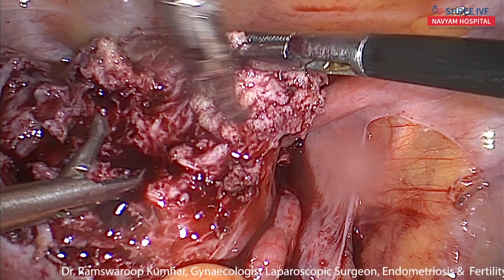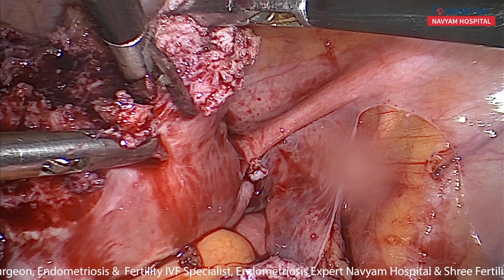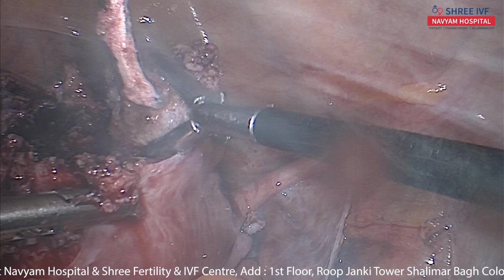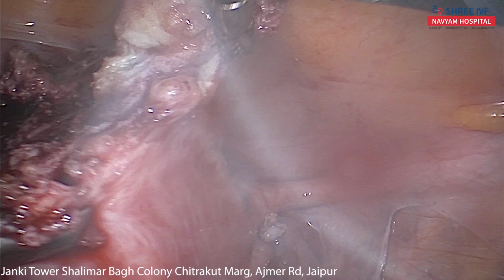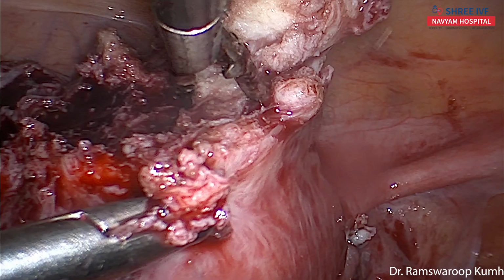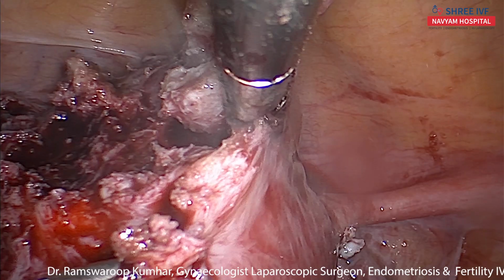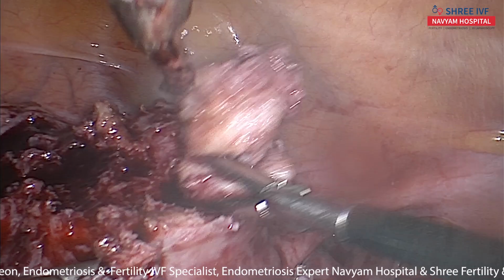This is adenomyotic, I think, more than the pure myoma. This is adenomyotic. Okay, no problem. So this is the remnant of this tissue, and we have to completely remove it out.